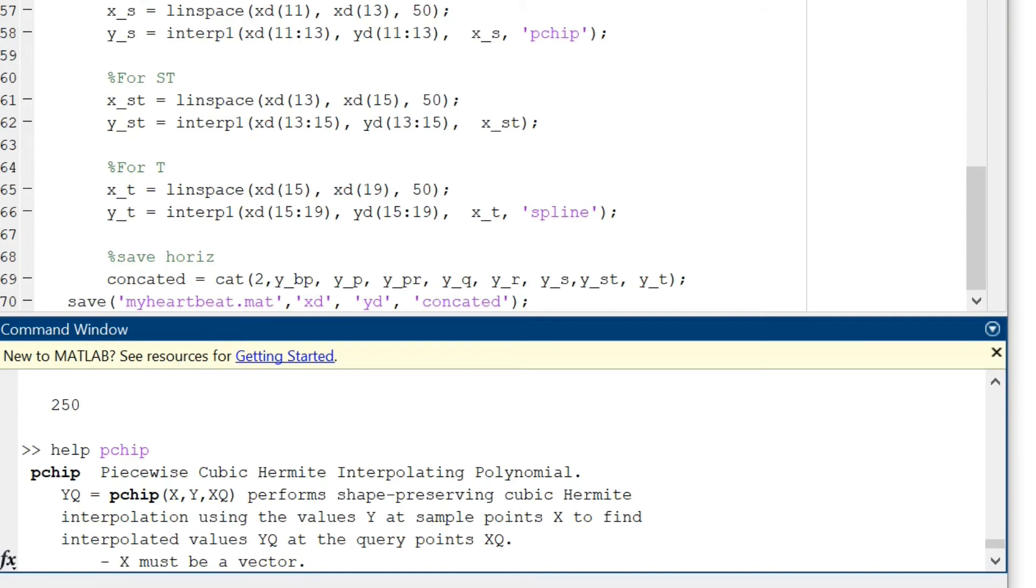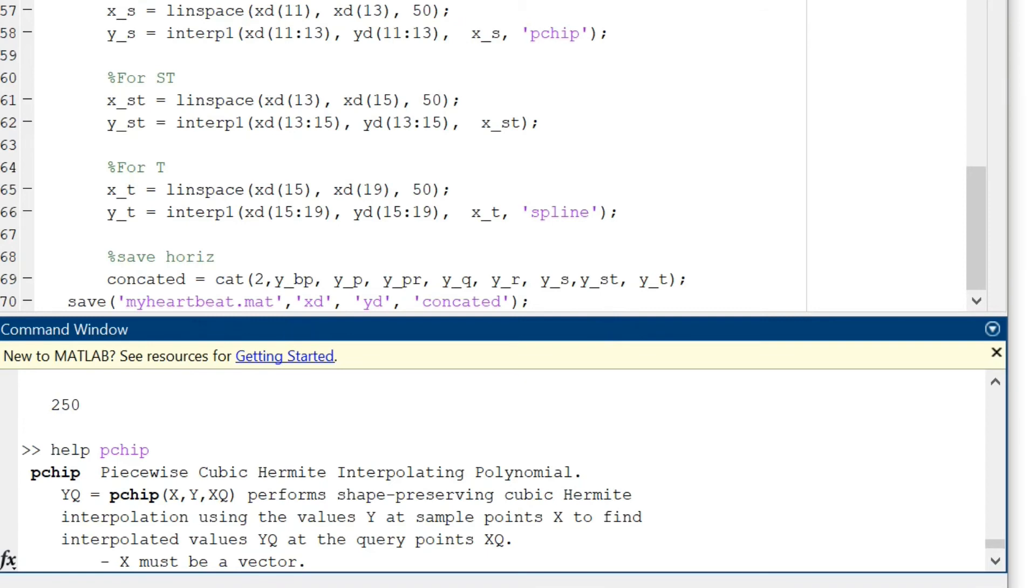Finally I will concatenate all the points that I have determined in the previous few steps using this simple cat function, which is used to concatenate data. I will save my heartbeat, basically this ECG curve of PQRST points, in my heartbeat.mat file.